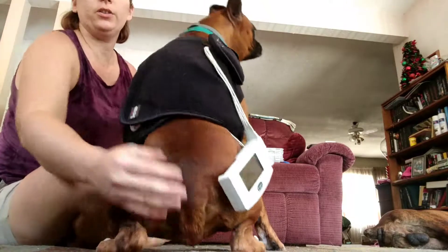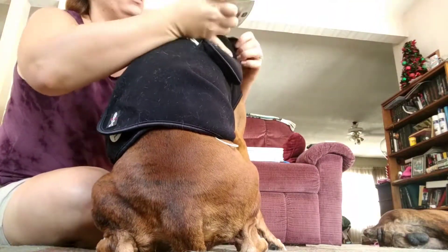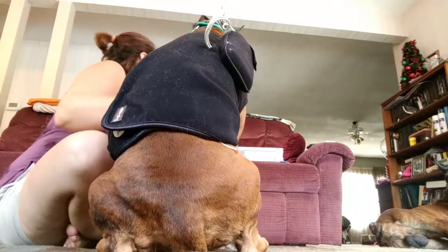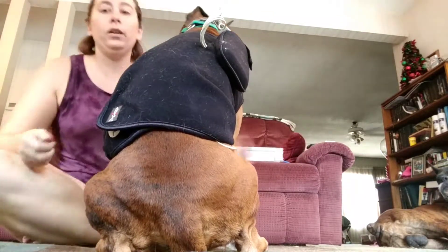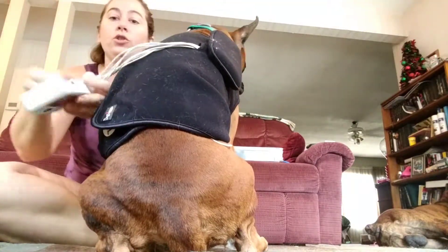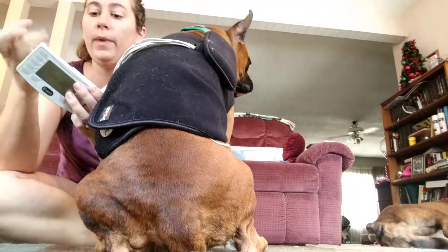Your Holter monitor is now dangling there through the hole. I have not stuck the batteries in yet. Now that the vest is on the dog, you want to go get your batteries and install them, then put the back back on the device.